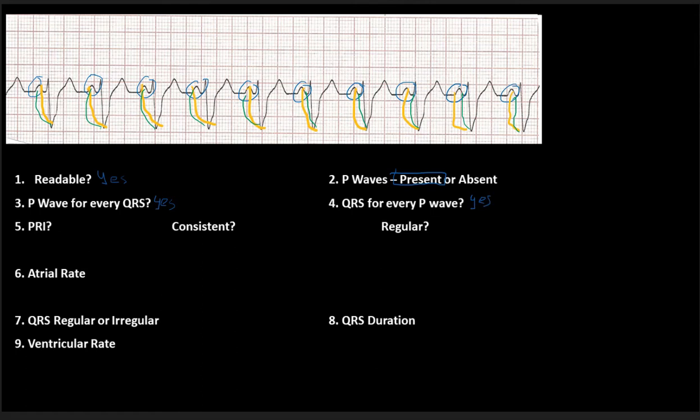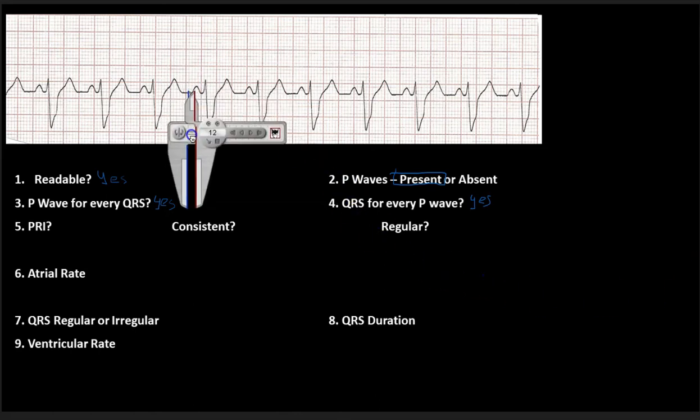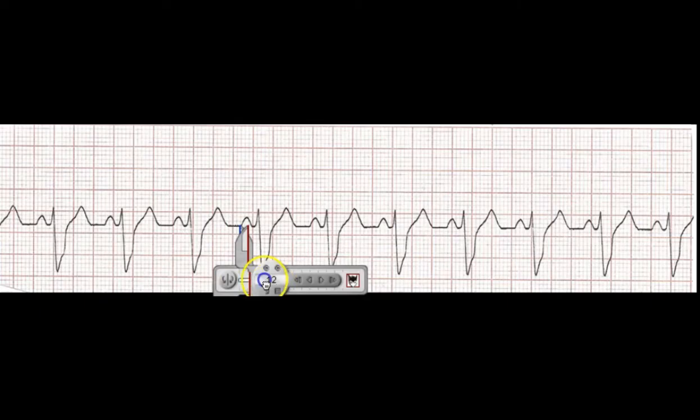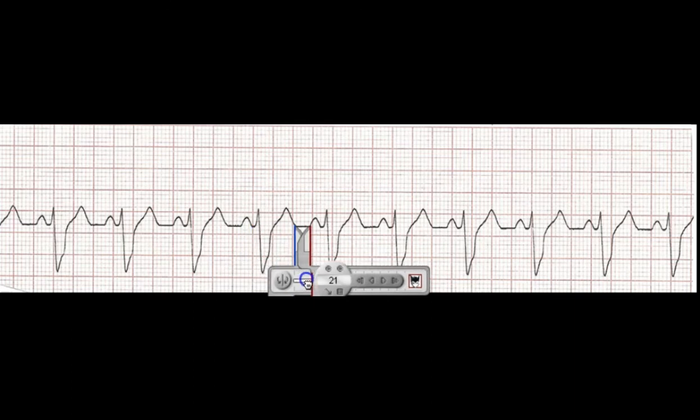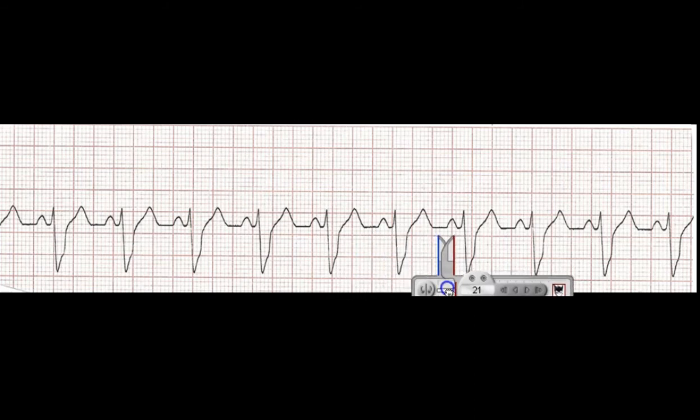Now I need to take a look at my PR interval. Is it consistent? And are things regular? So to do this, I'm going to pull in my calipers. And we're going to find a nice little P wave. That one looks pretty darn good. Look at my PR interval. So I'm now going to say, yep, that looks like my PR interval. Let's measure this sucker out and make sure that it is consistent.